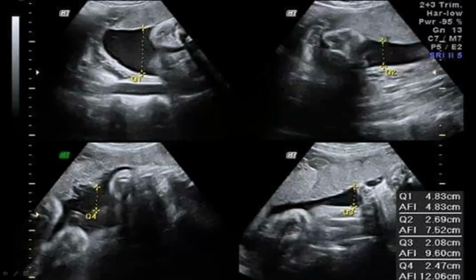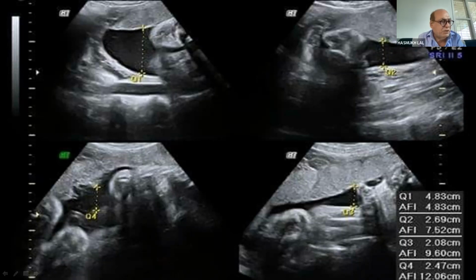Next question. The third question is for fetal presentation and lie. I also told about the principle of physics, the 90-degree. At this point there are a lot of other maneuvers of the transducer, like rocking and sliding, but those are applied later and not at the beginning stage. So for the present state, I think B is the right answer.